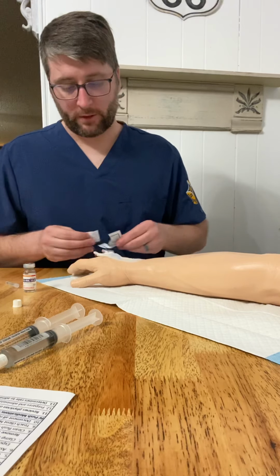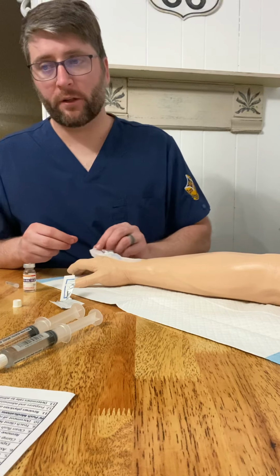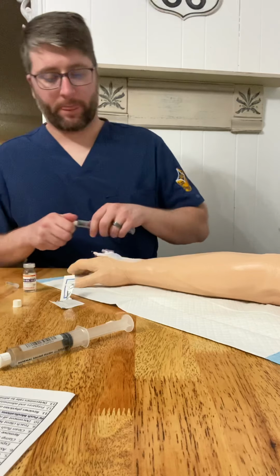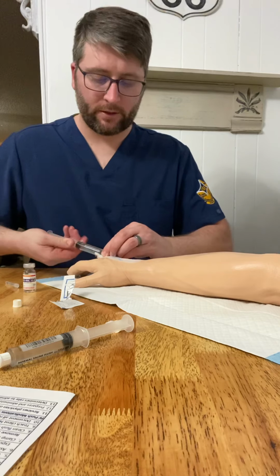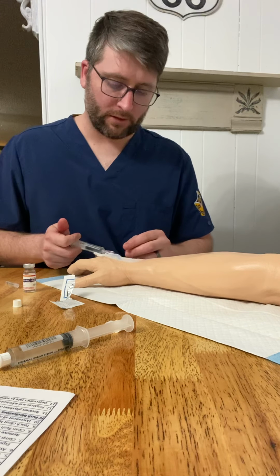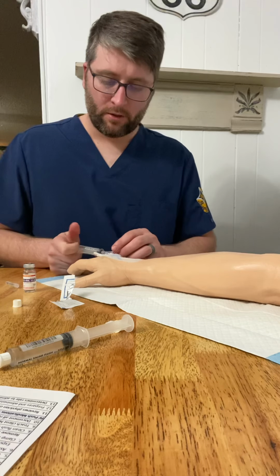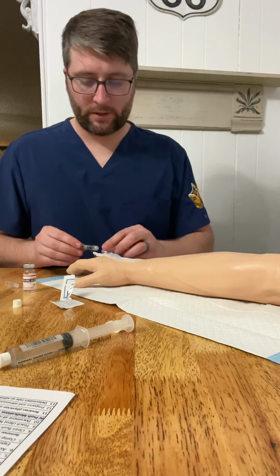Then we're going to use our alcohol swab, and we're going to disinfect our port vigorously. And then we are going to flush the line with 5 milliliters of saline, determine that everything's going good and that it is still patent. There's no swelling or irritation or pain at the site. And then I'm going to determine how quickly we need to do this.